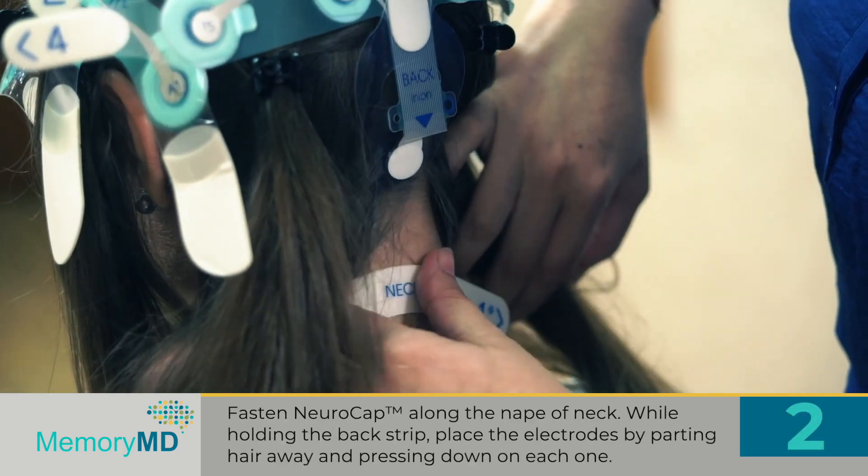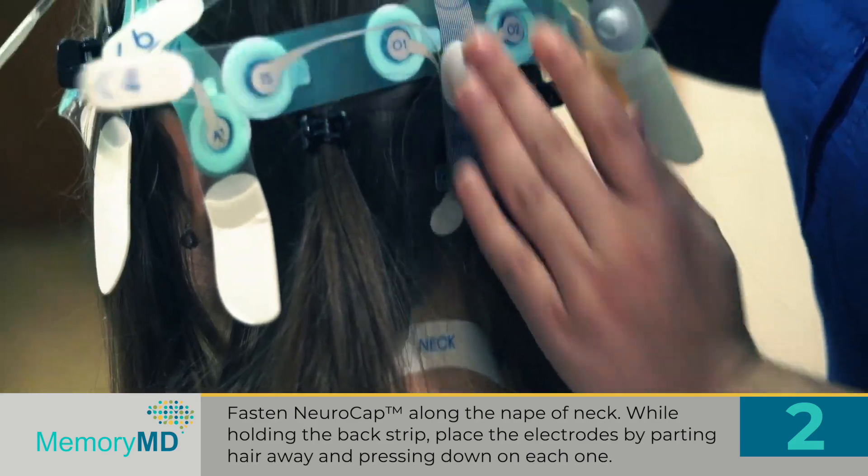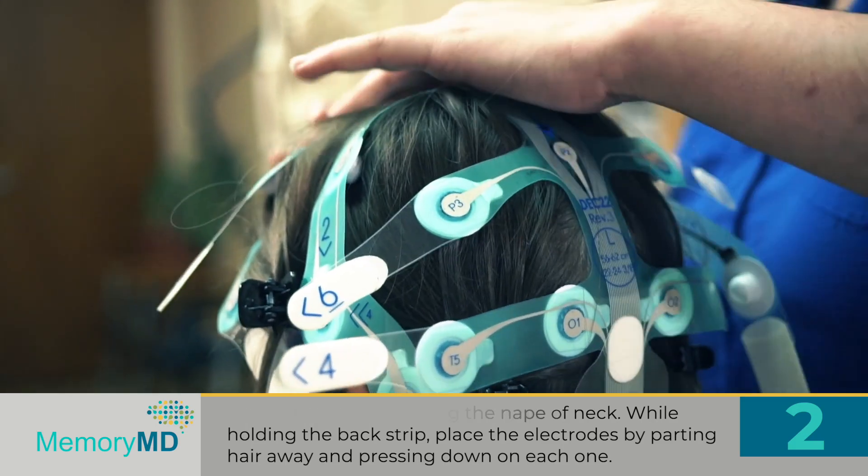Step 2: Fasten NeuroCap along the nape of the neck. While holding the back strip, place the electrodes by parting hair away and pressing down on each one.